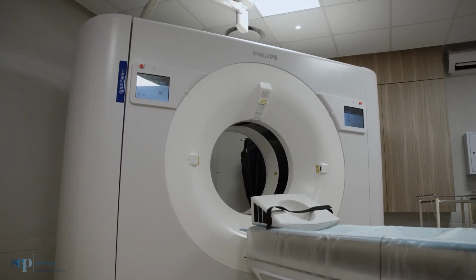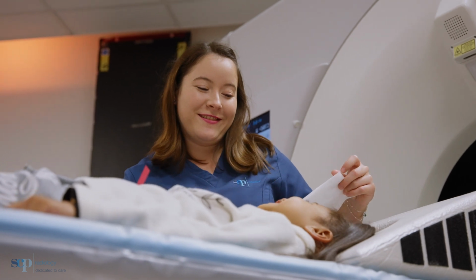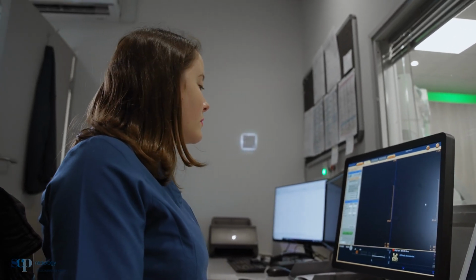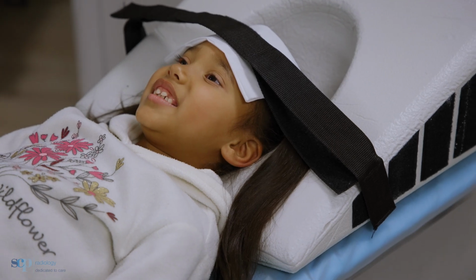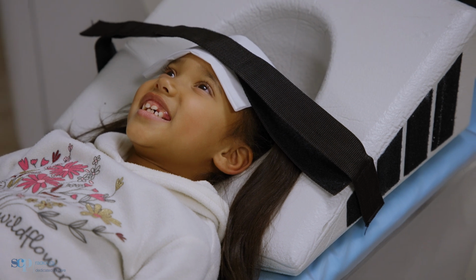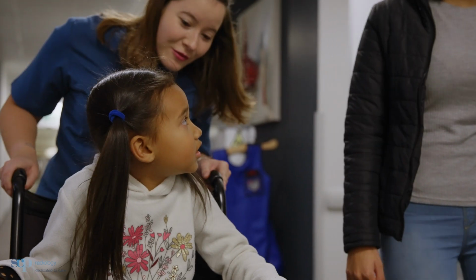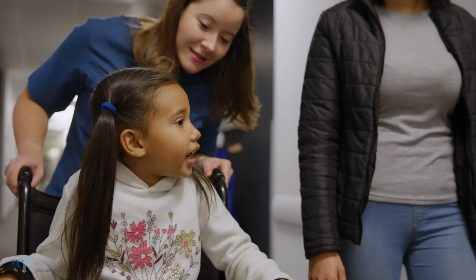When scanning pediatric children, obviously depending on age, the younger they are, the more difficult it will be to get cooperation. So that obviously makes it much more challenging. Going to the doctor, everyone looking at you, strangers, this big machine. It's overall just challenging to have to deal with pediatrics because it is so scary for them. So we try to make it as unscary as possible.